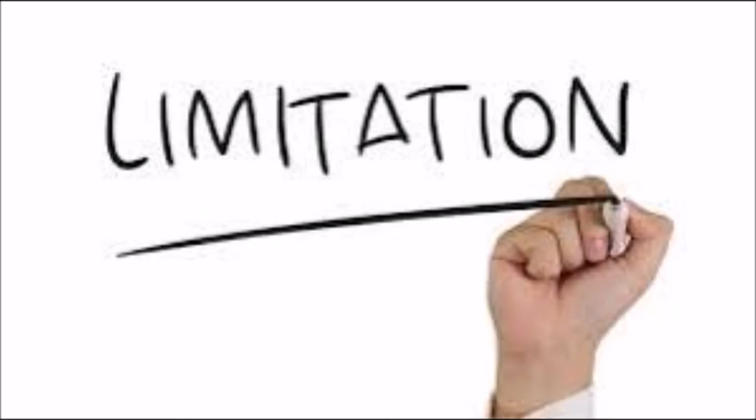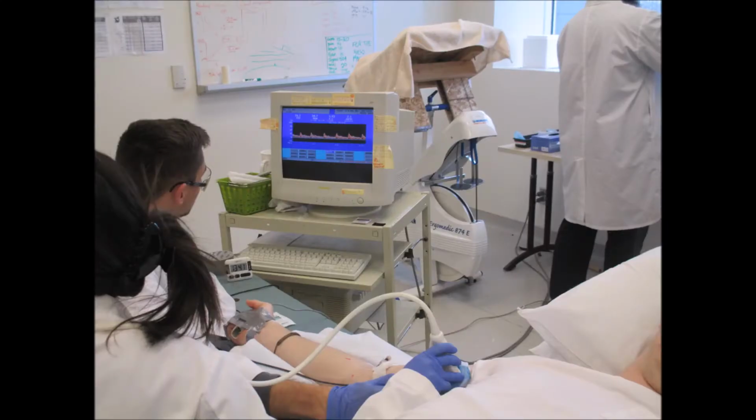Although a strength of using Doppler ultrasound is that it is a non-invasive procedure, there are a few limitations to the technique. For example, the probe is only sensitive to one velocity component. As such, velocity within only one vessel can be calculated or measured at a time. In this case, the velocity component that was measured was within the brachial artery.